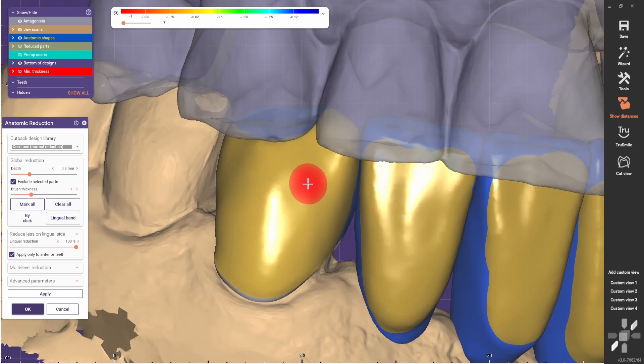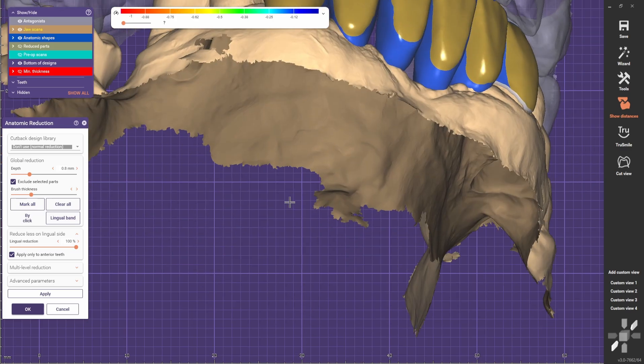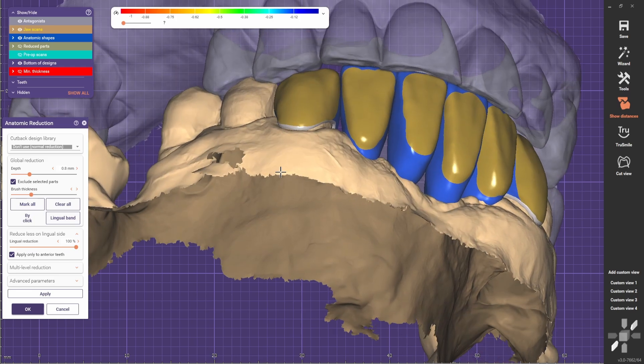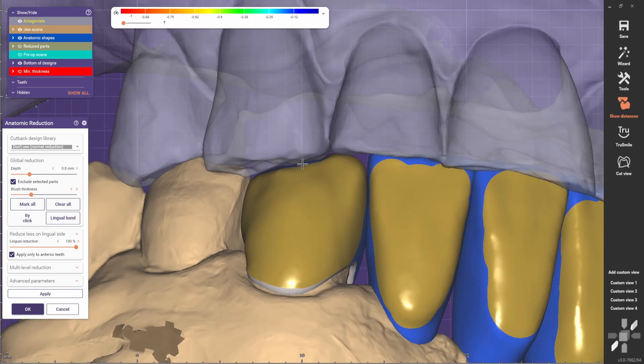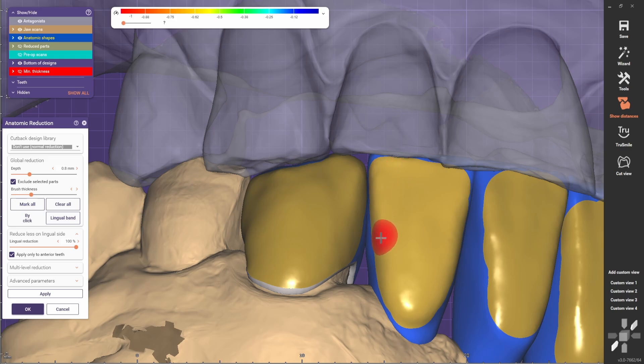Because this is a lower bridge, we will have to keep the contacts in full contour, especially given the fact that there is such a strong contact on this area. We need to protect the porcelain, so we should keep the incisal edges in full contour.